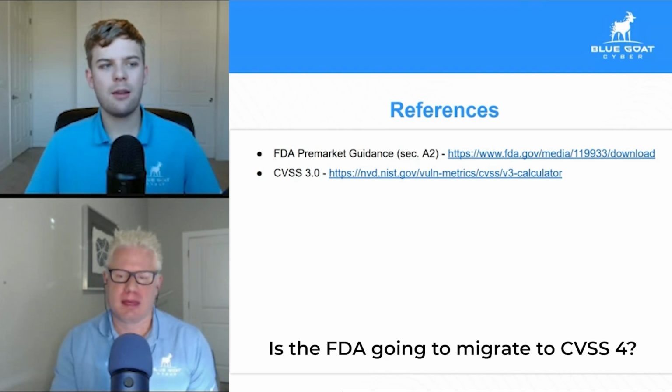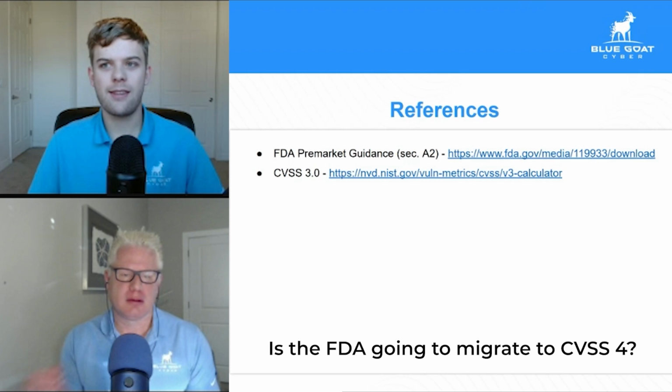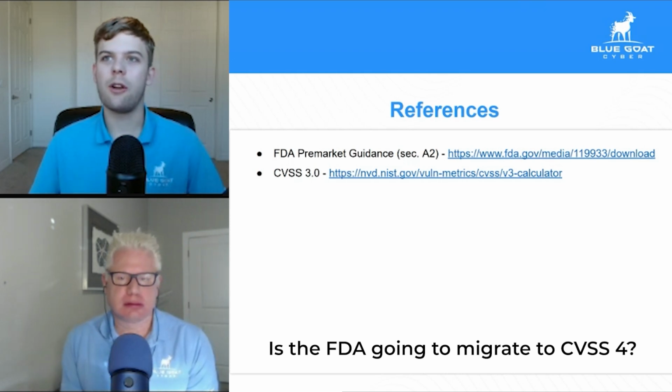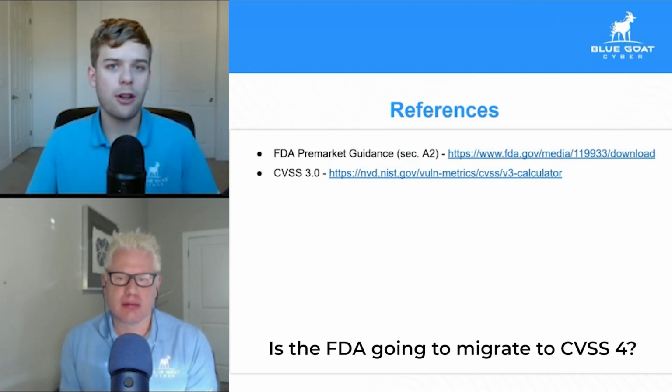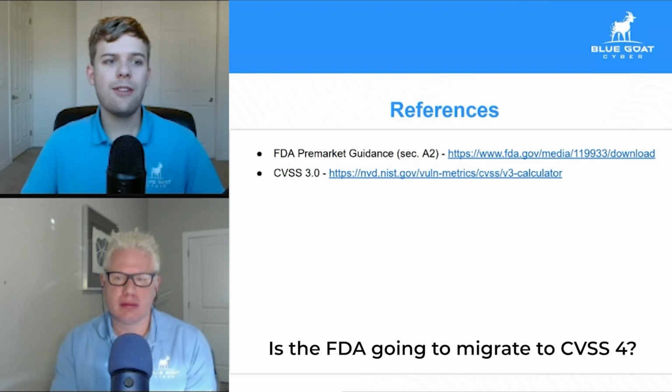So I don't think it's going to be anything coming up soon. A lot of what's important with CVSS is it looks at these other metrics that may not necessarily be applicable to a medical device. It looks at a lot of stuff that might tie in the post-market phase, but not necessarily in the pre-market phase. So I would say likely at some point, but I don't see it as a priority.